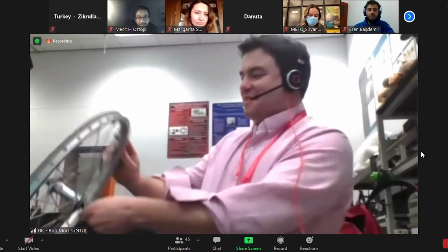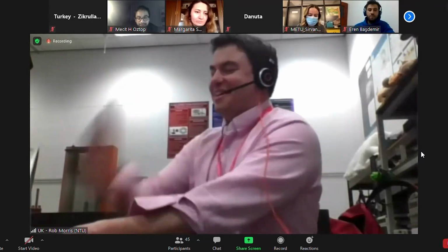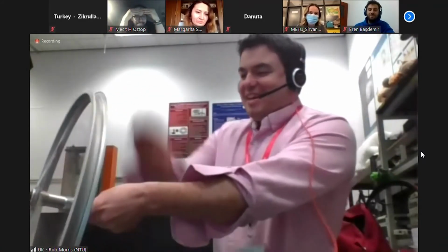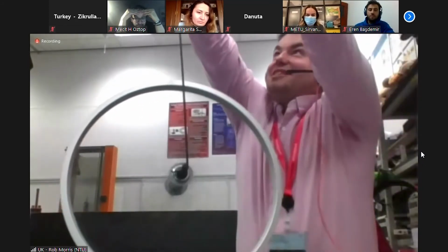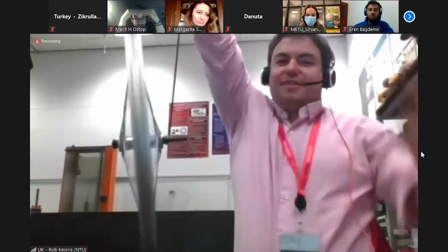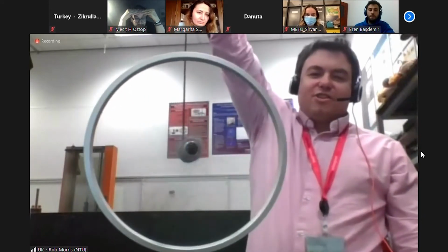We'll spin it up once more. Probably lots more. I find this so much fun. This time, instead of pointing it against gravity, I'm going to have it perpendicular to gravity. And now something interesting does happen. So I'm now not twisting this at all. This is its natural motion. And this motion is called precession.